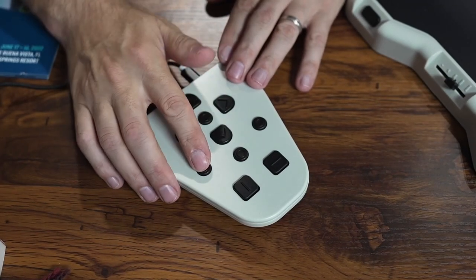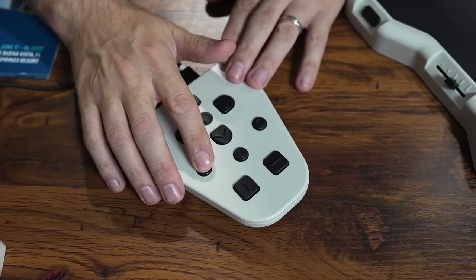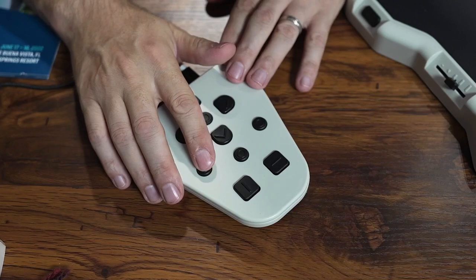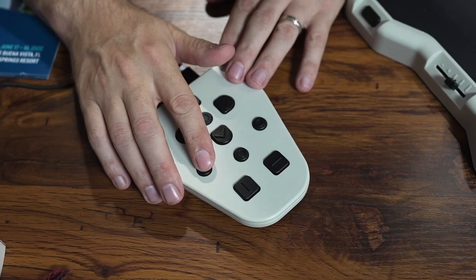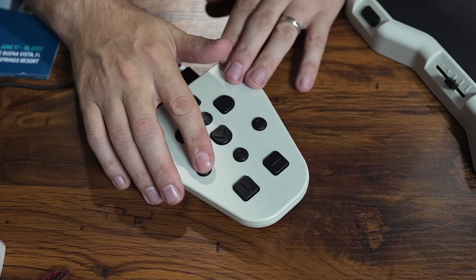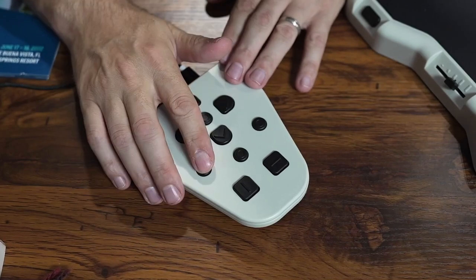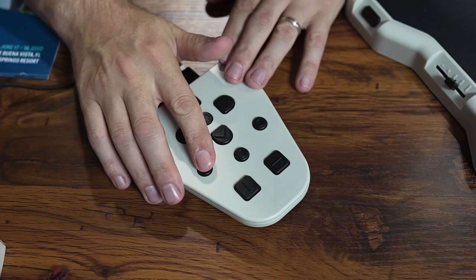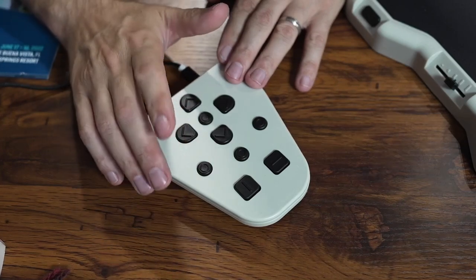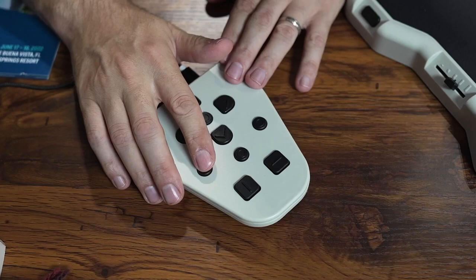The button underneath the left arrow adjusts your reading language and voice. You can cycle through options: there's a female Spanish voice, Nathan the male English voice, and Samantha the female English voice. English and Spanish are the only languages pre-installed on the device, but several other languages are available and can be installed upon request.